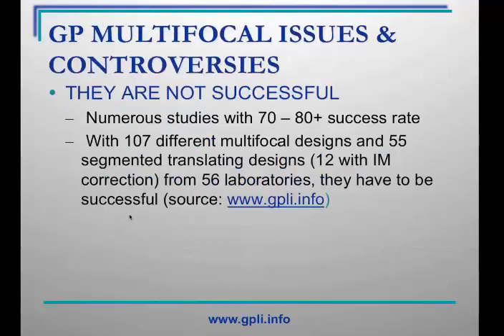Well, there are a few issues and controversies as they pertain to GP multifocals. Those individuals out there that say, well, they're just not successful. Well, there are numerous studies to back up that GP multifocals have anywhere from 70 to well over 80% success when fit. And with 107 different multifocal designs and 55 segmented translating designs, 12 with intermediate correction, from 56 laboratories, they have to be successful.